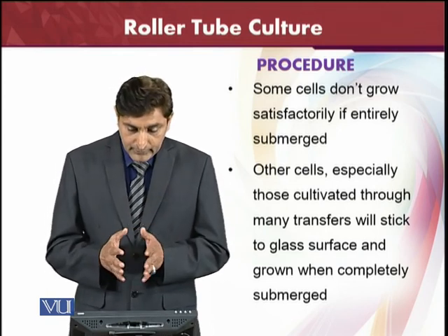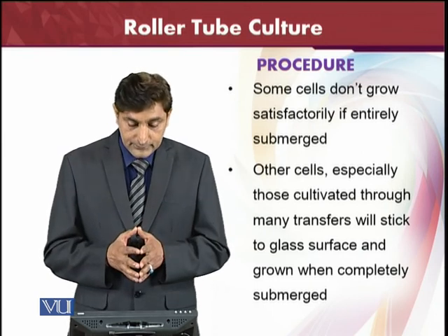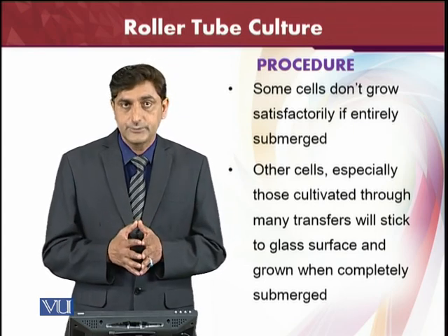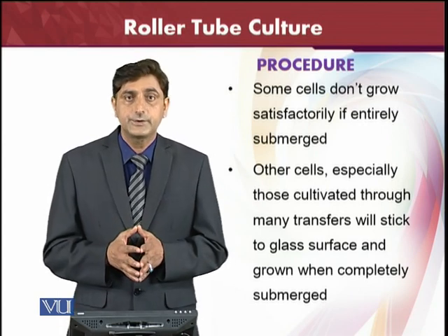submerged. Other cells, especially those cultivated through many transfers, will stick to the glass surface and grow when they are completely submerged. So it depends on your own experiment whether these cells are submerged or not. However, submerging is very important for this specific kind of culture.